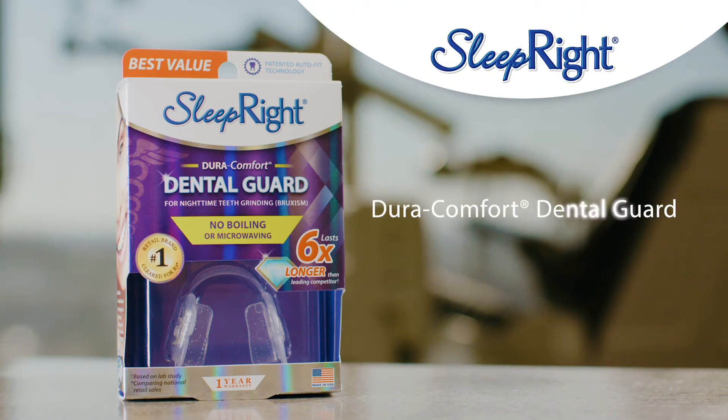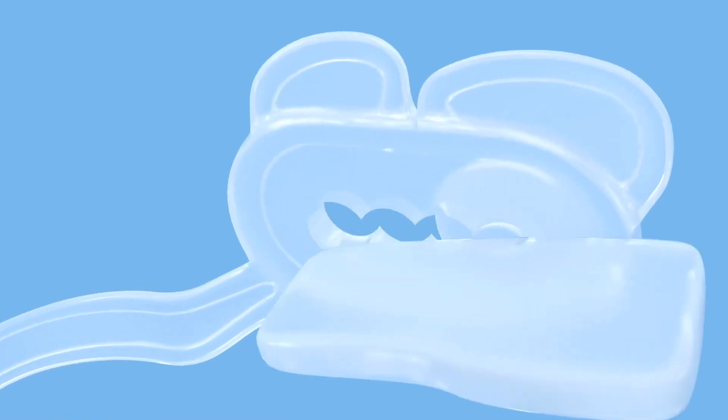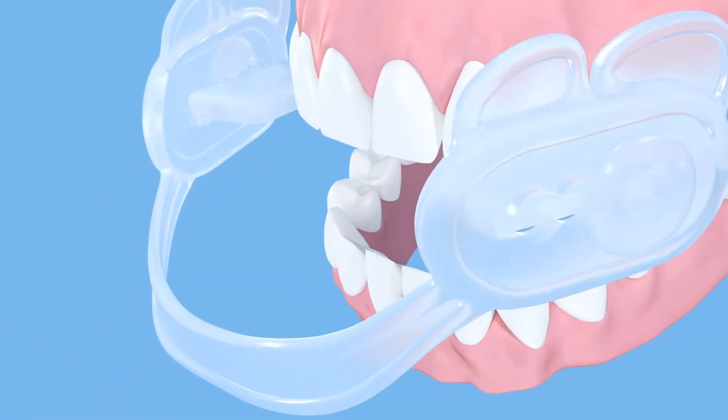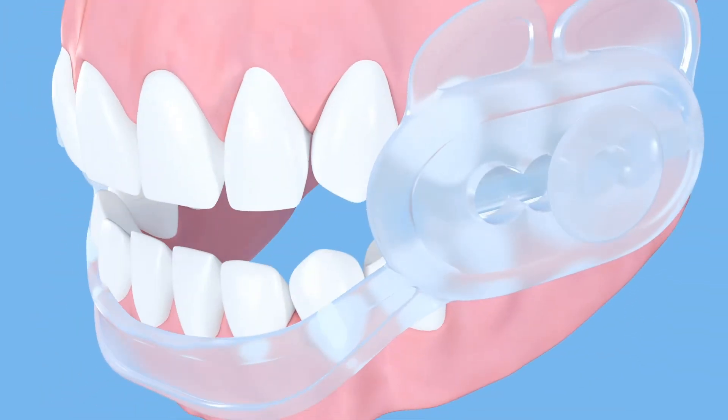The Sleep Right DuraComfort Dental Guard protects your teeth from the harmful effects of clenching and grinding, also known as bruxism. It's designed to fit all sizes with the help of adjustable bite pads. Before making any adjustments, check to see how it fits right out of the box. While looking in a mirror, place the dental guard in your mouth.